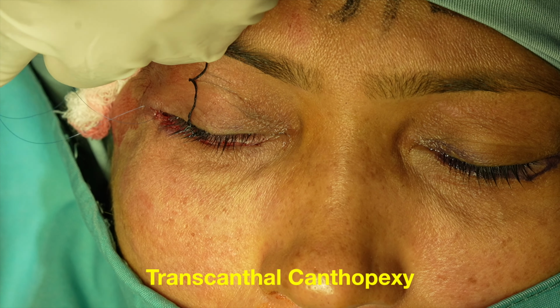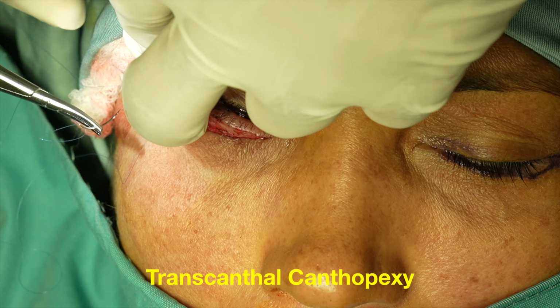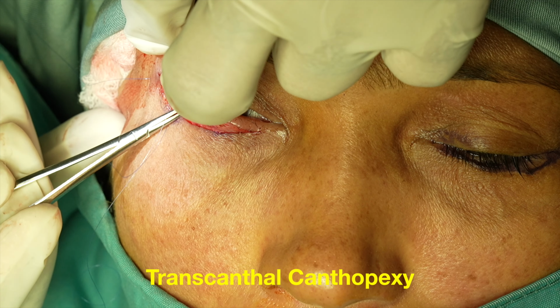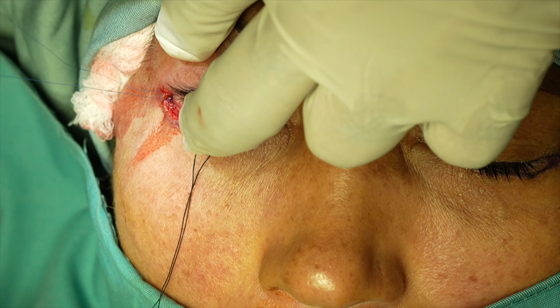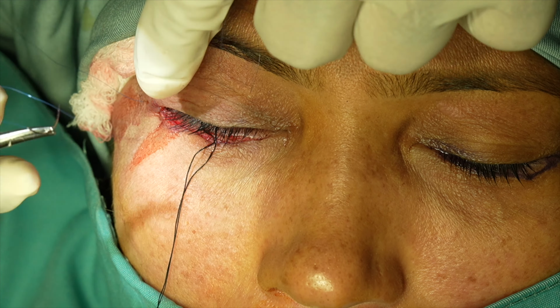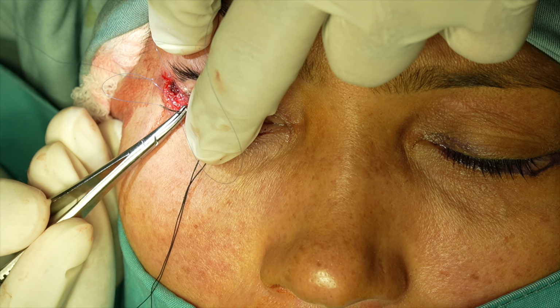A transcanthal canthopexy is performed to address the mild horizontal laxity and to provide additional lower lid stability. This is achieved using 5-0 Vicryl sutures for deeper support and 6-0 Prolene for the precision fixation.